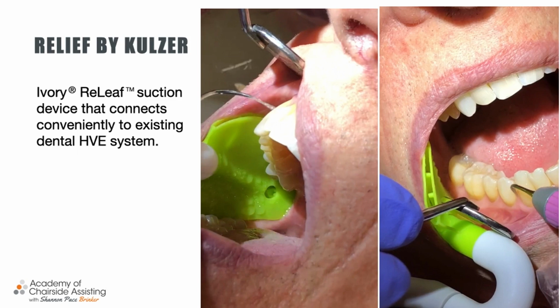Again, some doctors, we think about our occlusion camp doctors, Pankey, Dawson, Spear, they don't like to utilize a lot of bite blocks because they do worry about joints. So that's something to think about. This one does not have the bite block.